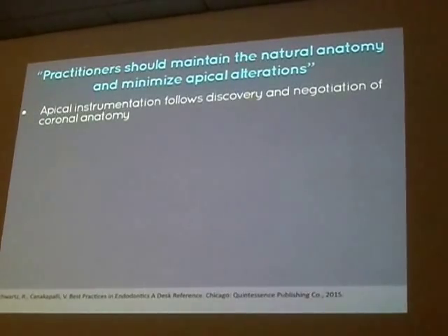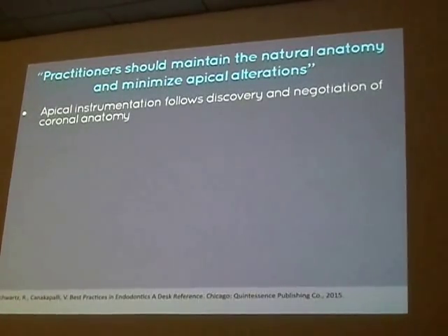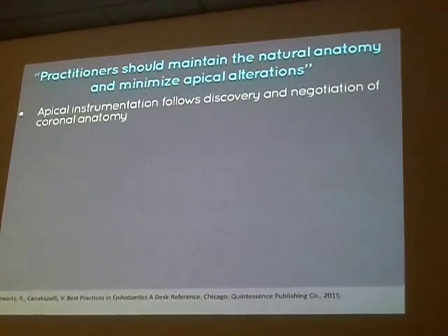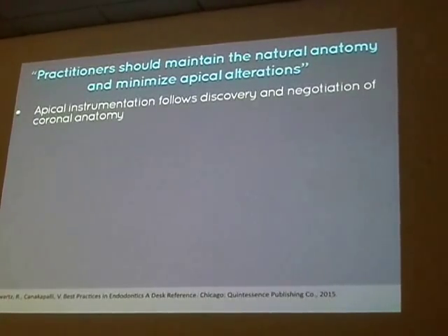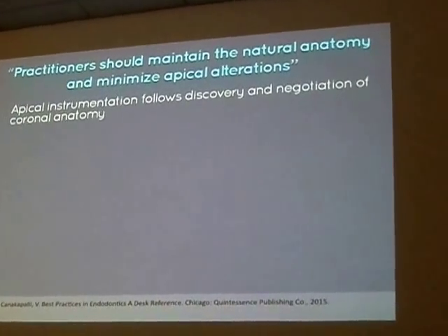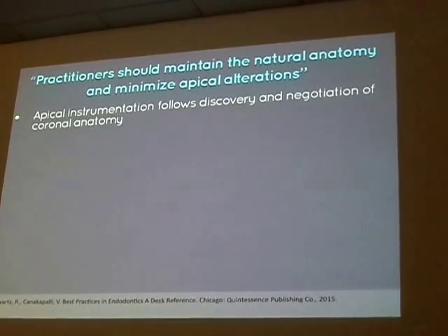Entonces, debemos tener en cuenta que la instrumentación a nivel apical, ¿no? Debe definitivamente seguir y tratar de preservar la anatomía a ese nivel, ¿no? Entonces, para poder llegar a poder negociar en esa zona es muy importante tener una adecuada preparación a nivel coronal.